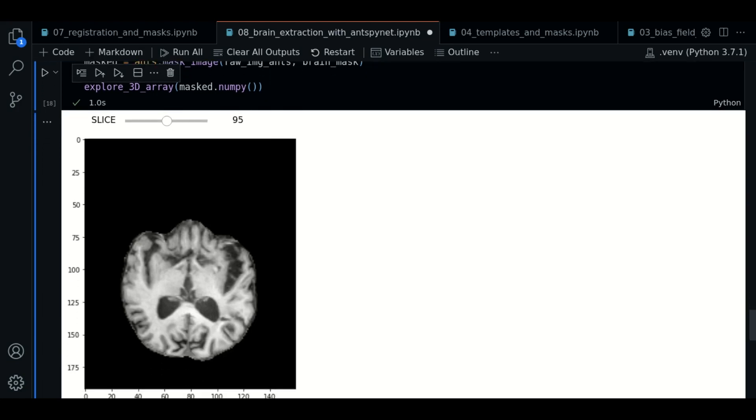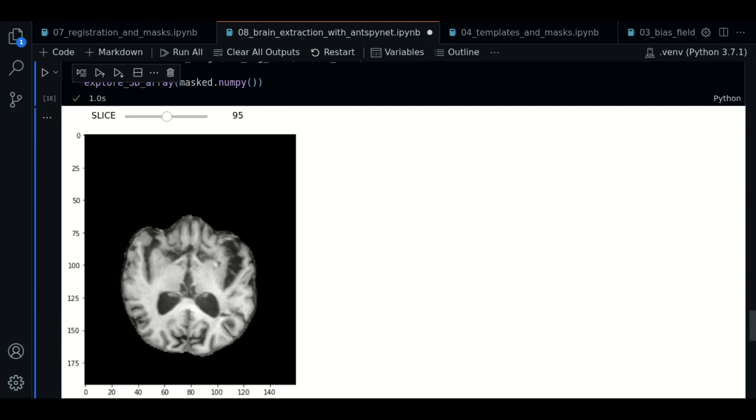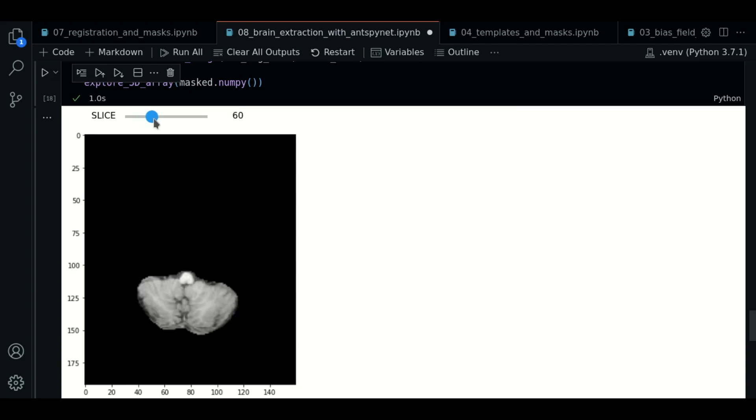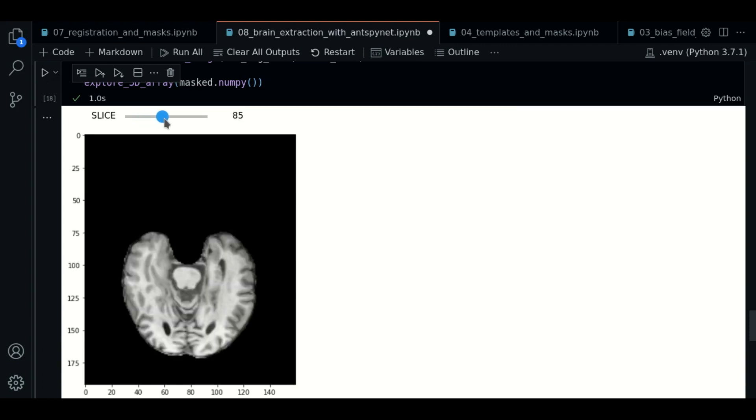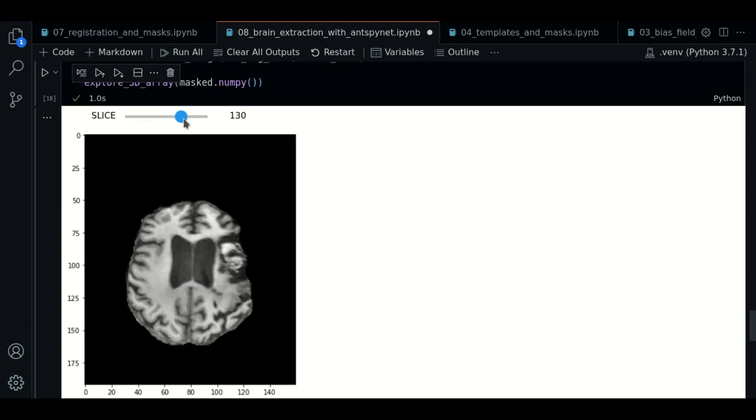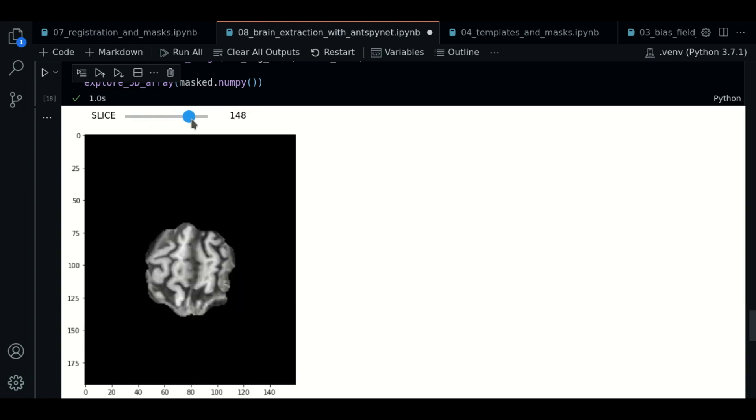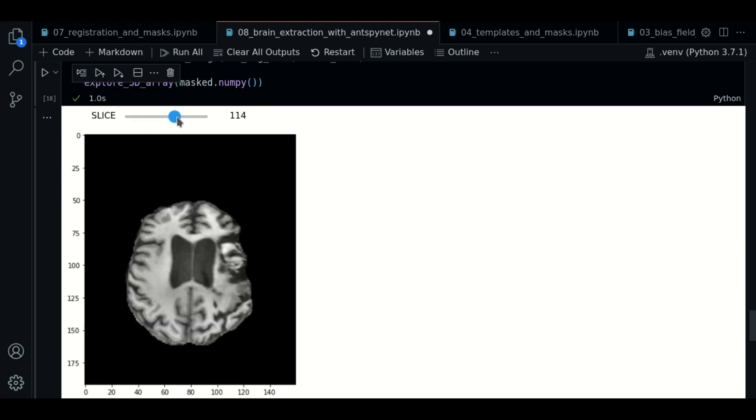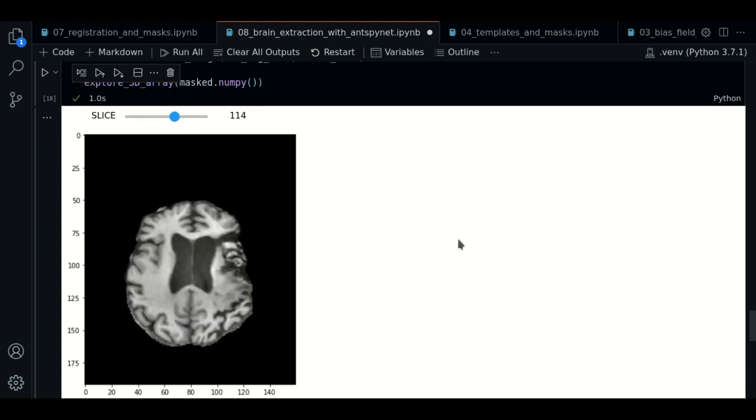So as you can see, now from the original image, we have extracted only the brain tissue. So this is the output of the brain extraction step.